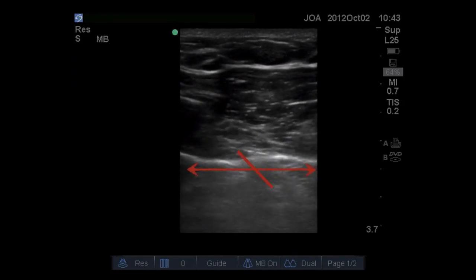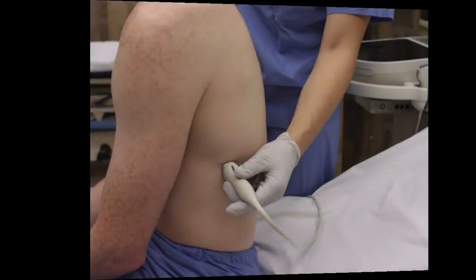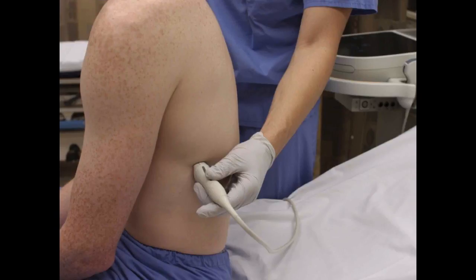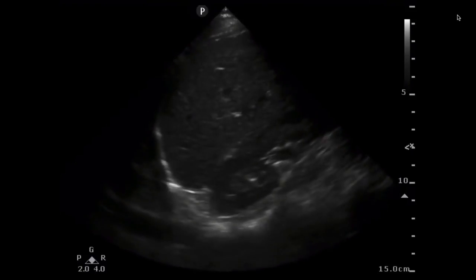for a pneumothorax. The last part of the RUSH exam involves the evaluation of a patient for a pleural effusion. You can do this at the end, or you can do it with the FAST exam. The reason I say that is because the location is very similar to the FAST exam. You're just going to be looking at a slightly different area. If you can get the patient to sit upright, you're actually going to be a little more accurate. This is the image that you're going to be looking at right here. It's very similar to the FAST exam like I mentioned before.